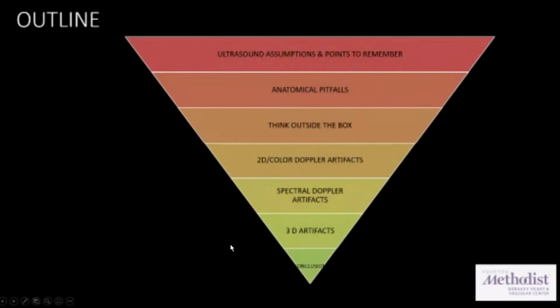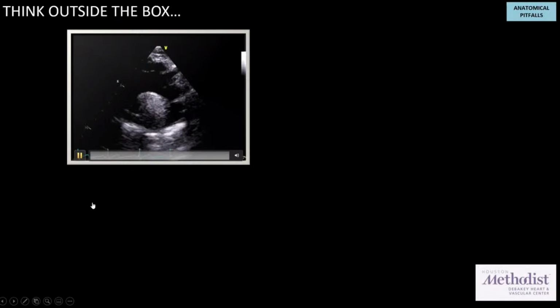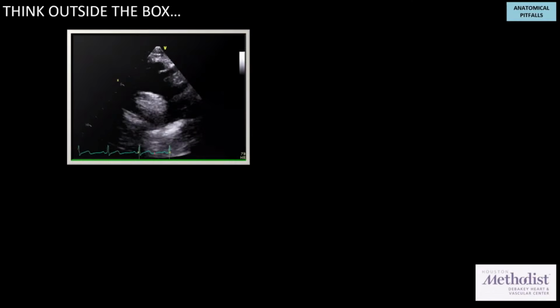All right. Now, let's talk about the real ones, right? And we also see thinking outside the box. Let's see if all of you can guess this one. Do we have any fellows who want to take this? I see Sadhura, Smita.